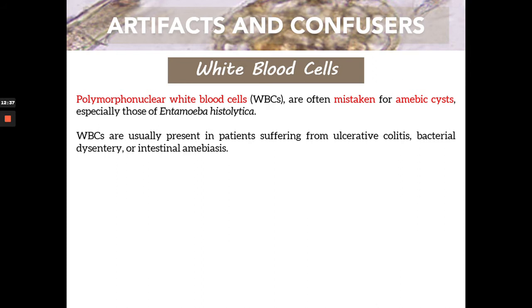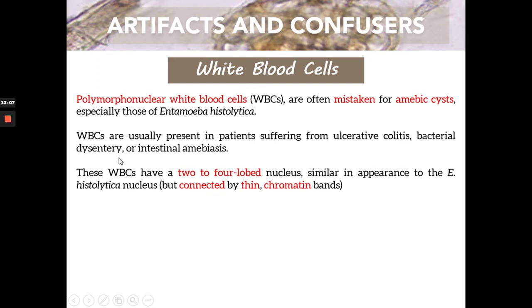WBCs are usually present in patients suffering from ulcerative colitis, bacterial dysentery, or intestinal amoebic infections. Because these are infections, your WBCs will be increased and can also be recovered in your stool. Their appearance features a 2-to-4-lobed nucleus, similar in appearance to the Entamoeba histolytica nucleus, but the lobes are connected by thin chromatin bands.